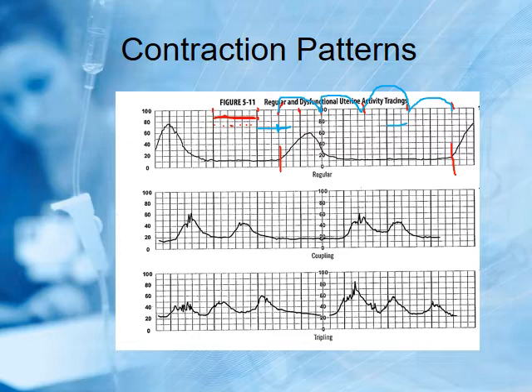The other way I mentioned, you could do it from peak to peak. All right, see the peaks? So let's count these. Oh, this happens right on the heavy line. See that? So this makes it a little easier. From here to here is 1 minute, 2 minutes, 3 minutes, and a little bit. When I say a little bit, we are not so picky that you have to go 3 minutes and 10 seconds. But you'll say every 3 minutes here.